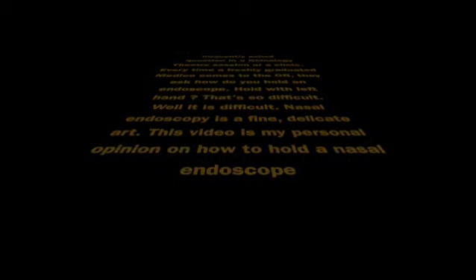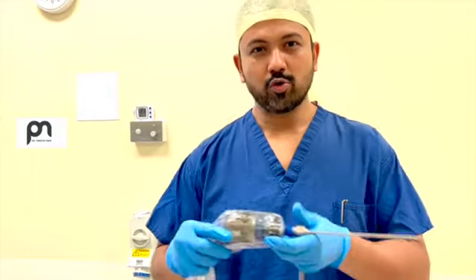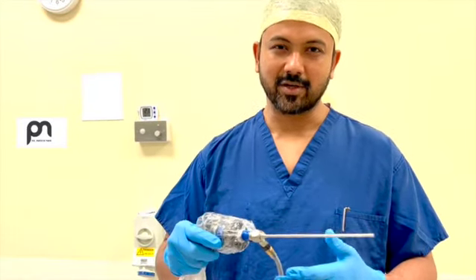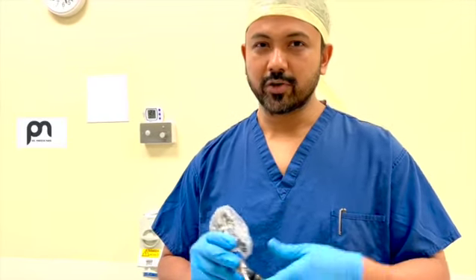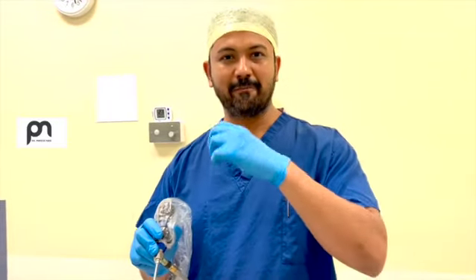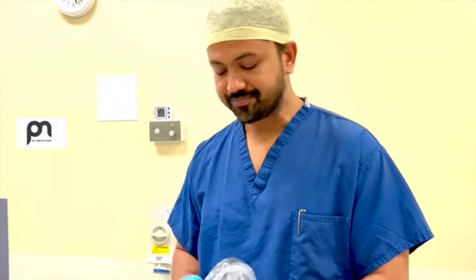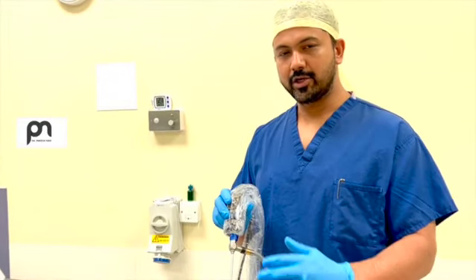So here we go. So many people ask this question, how to hold an endoscope? And that's the first thing to begin with. Holding an endoscope is very crucial because if we are not holding appropriately or properly, we'll have pain not only in our hands, but also at the elbow and shoulder. So first and foremost, you should be relaxed.